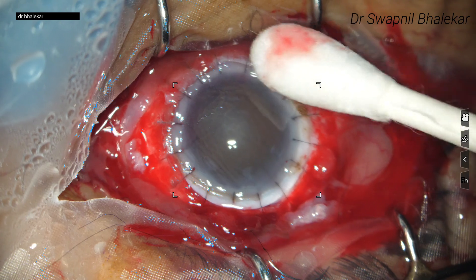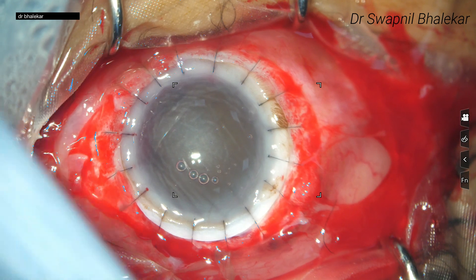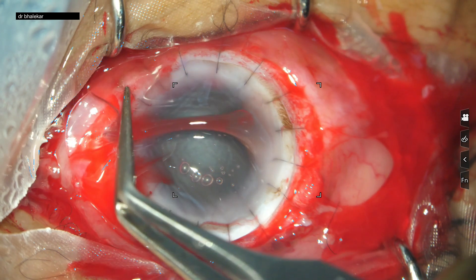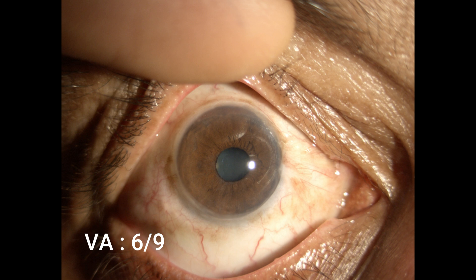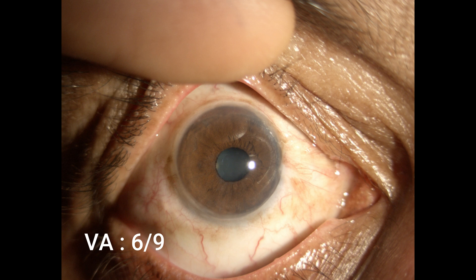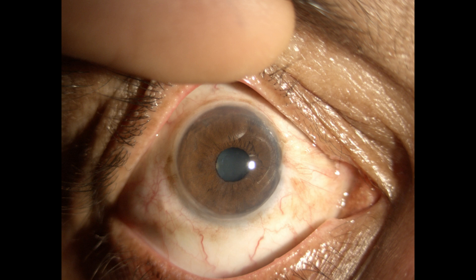Check the graft-host junction thoroughly for any leakage, then place a bandage contact lens — and this is the end of the surgery. Two weeks after surgery, this patient was started on topical steroids once it was confirmed that there was no recurrence of the infection. This photograph taken one year after the operation shows the eye achieving a visual acuity of 6/9 without correction. This case underscores the importance of dedicated treatment for such eyes, emphasizing that vision can indeed be restored. It serves as a reminder that there is always hope in every situation. Thank you.